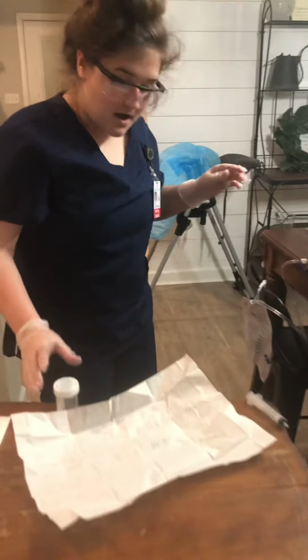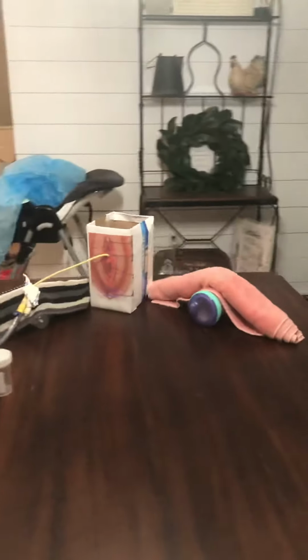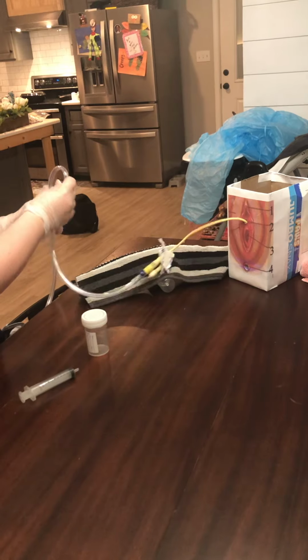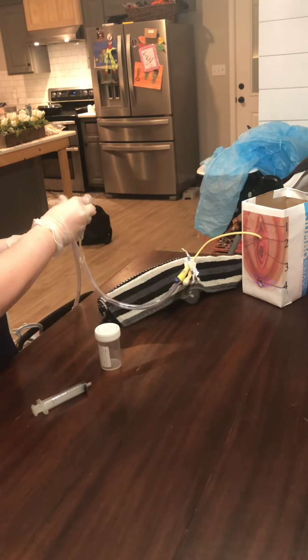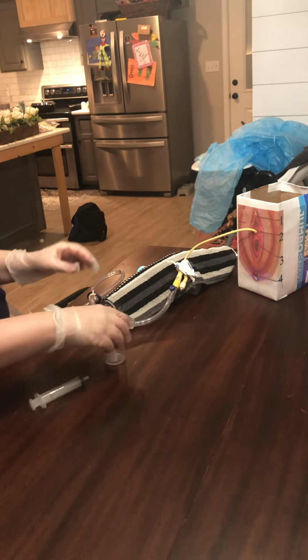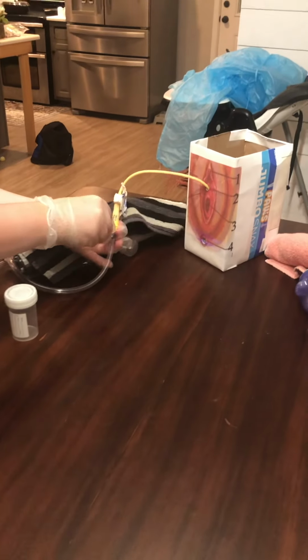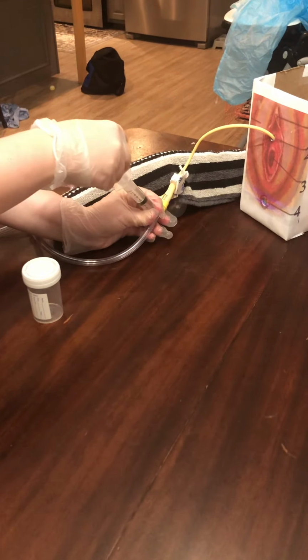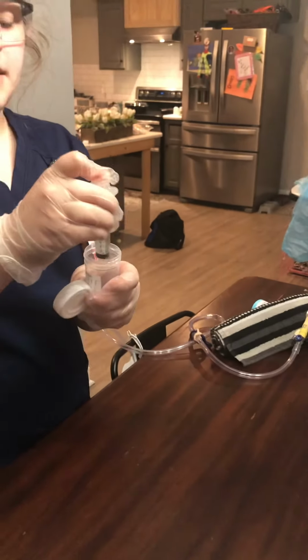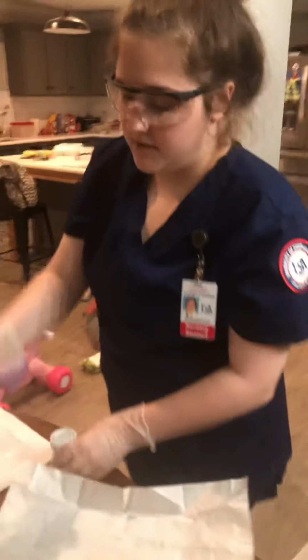So then to get it from the port, this is when my syringe goes back in. So to get it from the port, I'm just gonna clamp the tube. So I'm gonna get my syringe, I'm gonna put it in this blue port. And I'm just gonna aspirate however much I need. This will be opened up, and then I'm just gonna squirt it in there, put the seal back on, put my label back on, and then I would be done with that, and I would discard this.